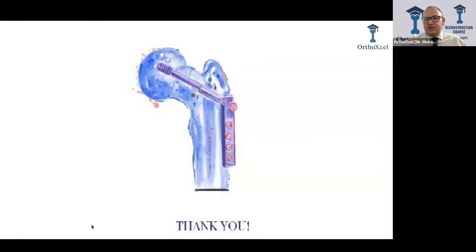Ahmed has a question. Any method we can adjust the limb length without changing the offset? Theoretically, yes. Practically, no. So the answer is it is a triangular relation. So there is no way to change a limb of the triangle without changing the whole triangle. So changing one limb of the triangle has to change the other limbs of the triangle.